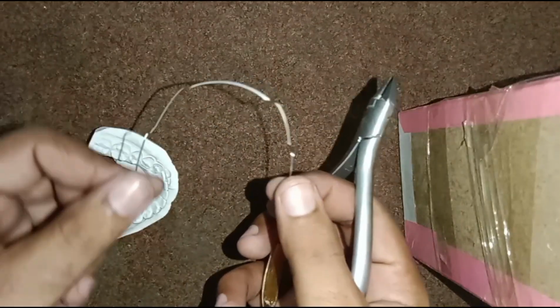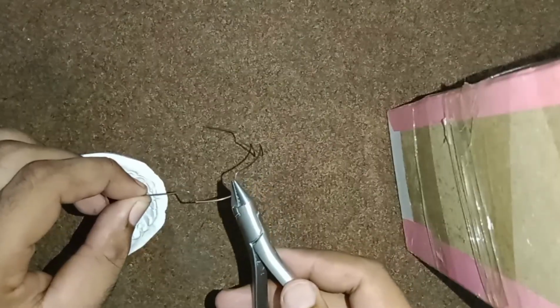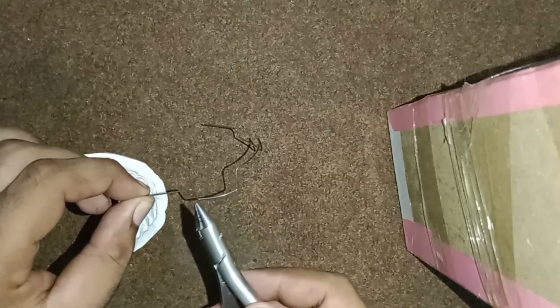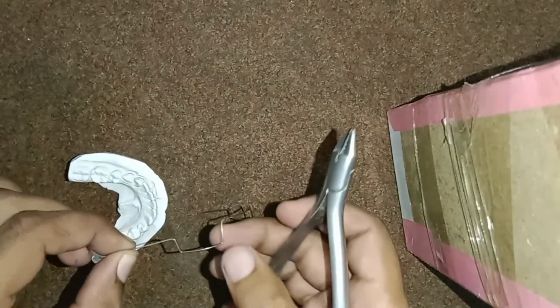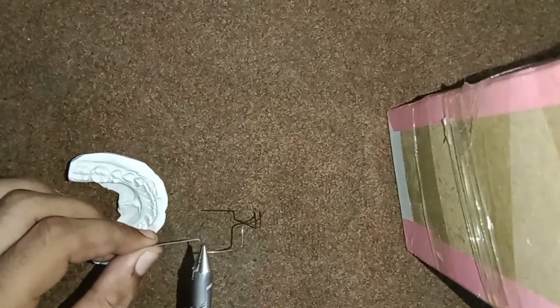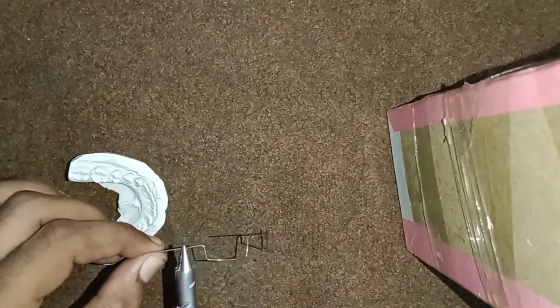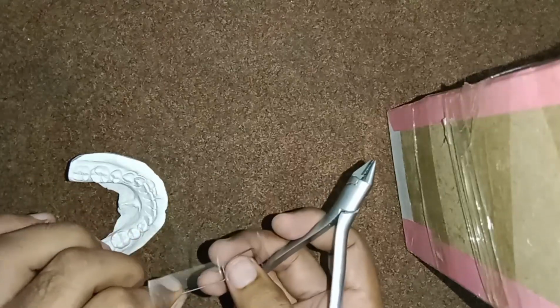This is the wire intrusion arch. It is going down distal to the lateral incisor, then bypassing the premolars and canine, then again mesial to the molar. It is upward. It is passed through the accessory tube of the molar, right and left side, both sides.